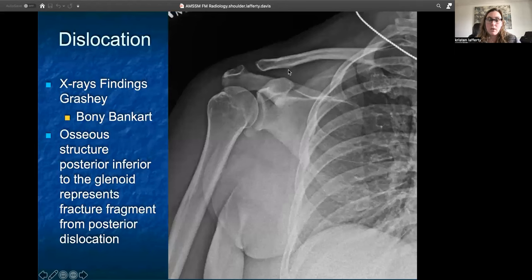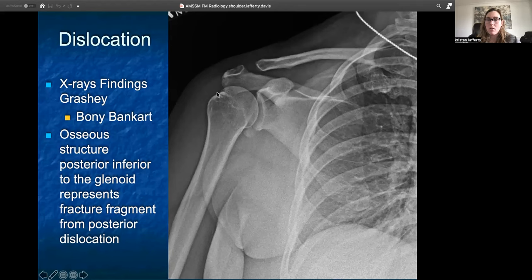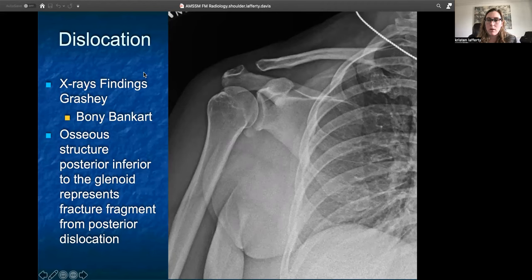On this Grashey film, we're showing an example of a bony Bankart lesion, which is this fracture fragment or calcific density just inferior to the glenoid rim. When the humerus dislocates anteriorly or posteriorly, it can actually knock off a piece of that glenoid, leaving a fracture fragment. You can also have inferior dislocations that do the same thing, but different views will show some of those glenoid issues better. The Grashey film is great to look for a possible bony Bankart lesion.